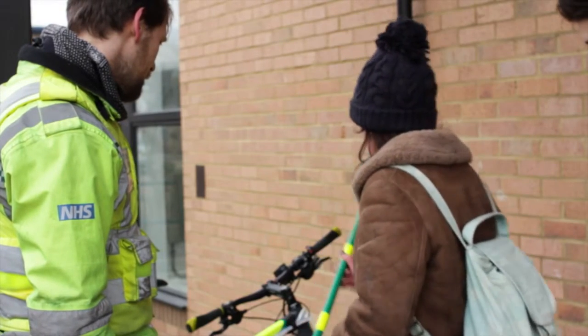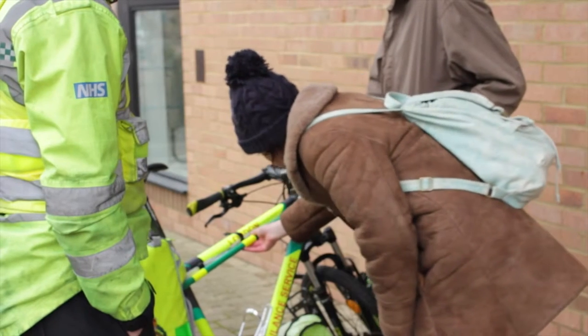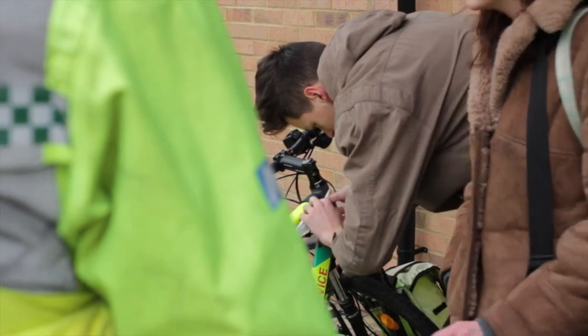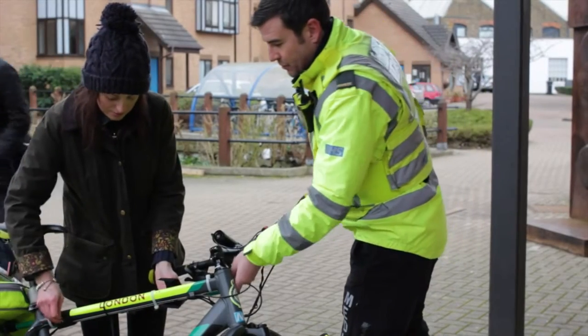When we finished the prototype, we met up with Ben again and tested it against the size of the bike. We realised it was a little bit too long and it could do with a few tweaks and changes. We also thought it would be great to fit it to the three other members of his team and their bikes.